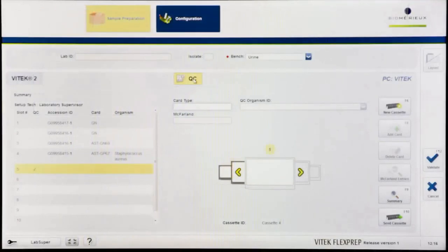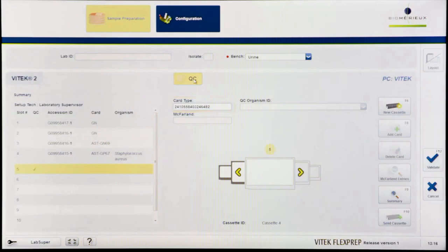Enter the card barcode by scanning the barcode or manually entering the number. The card type, shipment date, lot number, and expiration date fields will populate if the user entered a QC shipment in the Vitek 2 web application.